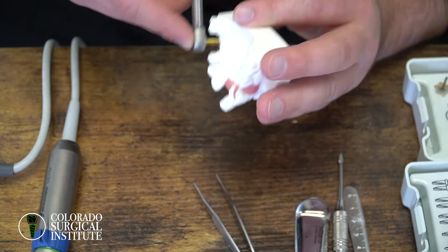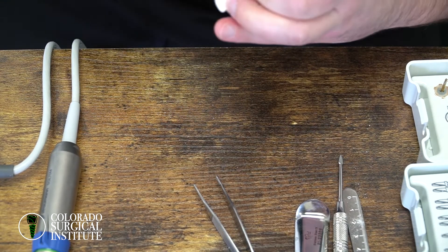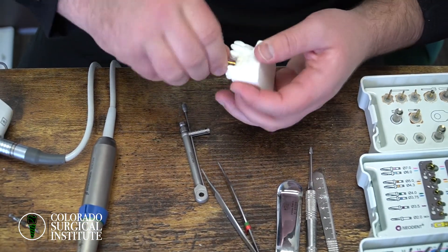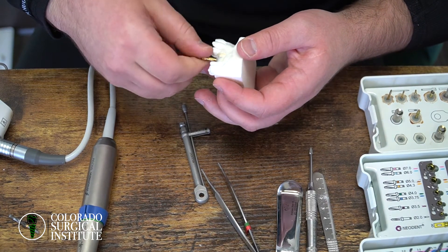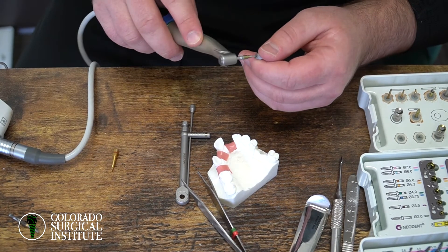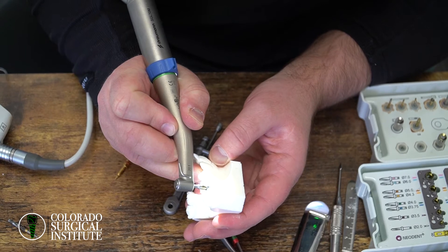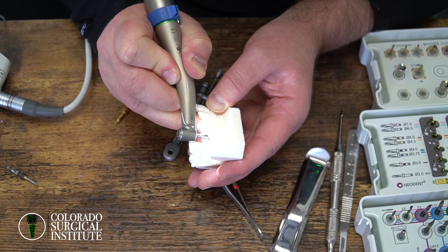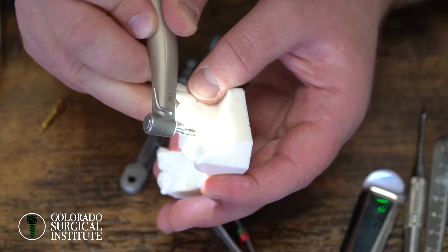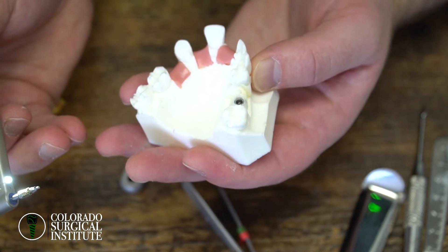Now let's talk about the alternative — where we're putting a 4.3×11 implant in and as you're putting it in with the handpiece, remember your setting: 30 newton centimeters is your stopping point. Let's say you're putting it in and it just keeps going — past the cortex, one below — and it still hasn't stopped. You're one millimeter below already and it still hasn't torqued out. So your implant is in the perfect position.